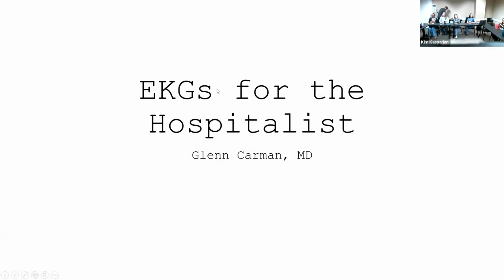About EKGs. EKGs is an enormous topic, and it has infinite levels of minutia and nuance. So it's sometimes hard to know where to draw the line. But I'm trying to keep this to things we're going to see and things that are actionable for us, things you're going to actually get called about, and that it would be helpful to be able to identify.